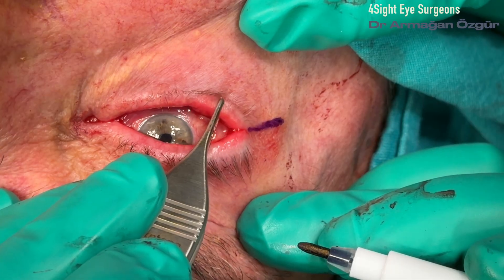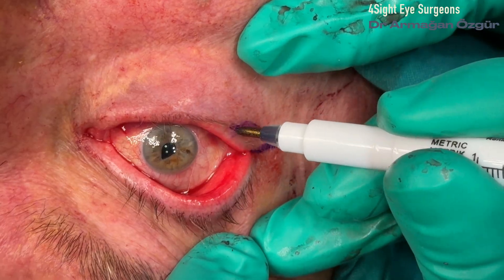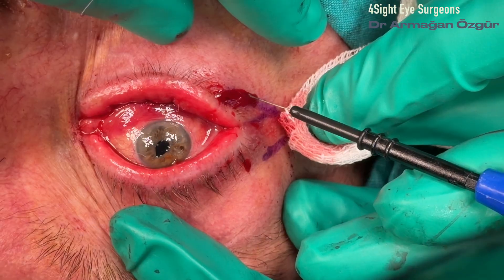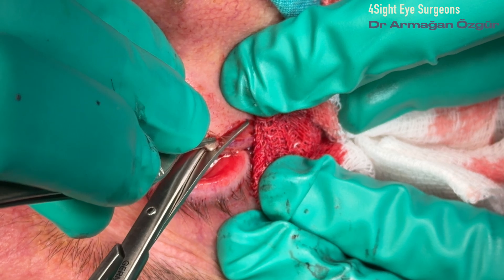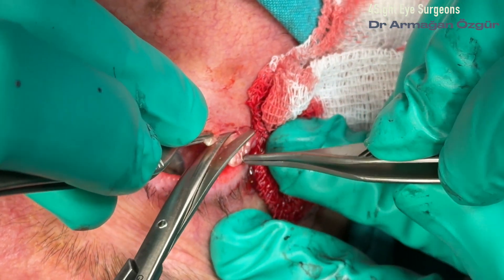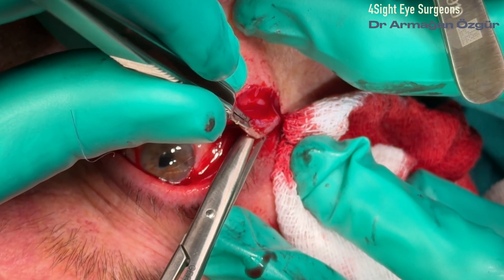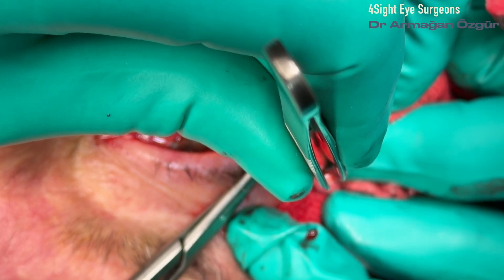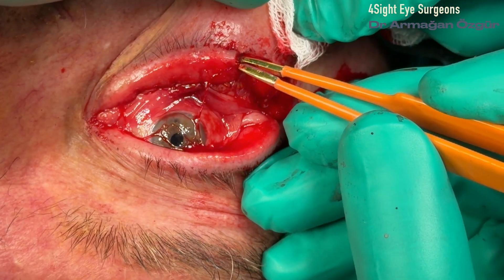Now it's time to move on to the BICS procedure. The procedure begins with excision of a triangular wedge from the lower eyelid margin, followed by fixation of the released tarsal plate to the periosteum of the lateral orbital rim. Suture fixation to the orbital rim should be positioned at the same level as the upper eyelid crease. The lateral wedge is then excised using scissors, and the orbital rim is exposed using the same instrument.